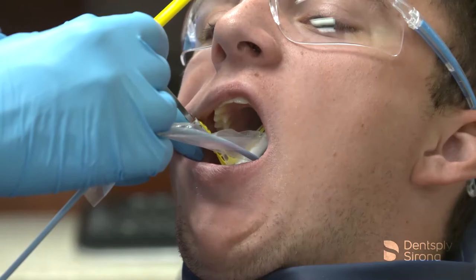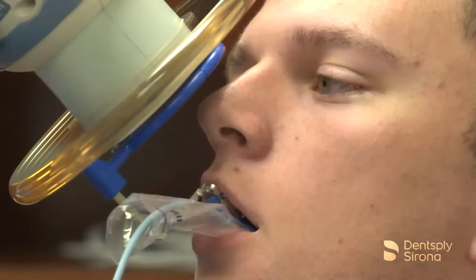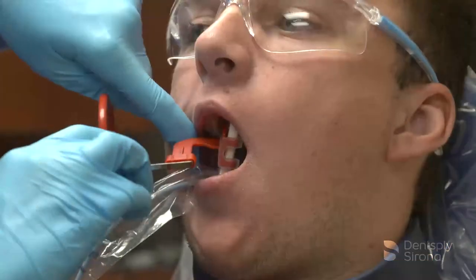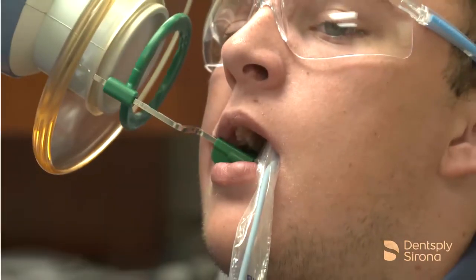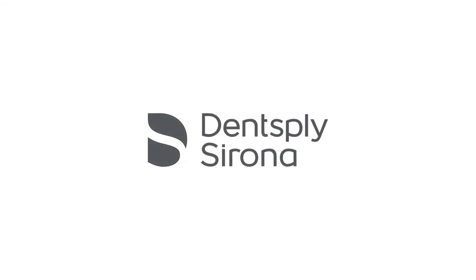Using the XCP short arm aiming device with a handheld portable device and following these simple image receptor placement recommendations can aid a clinician in capturing quality images. Thank you for viewing this instructional educational video brought to you by Dentsupply Sirona.